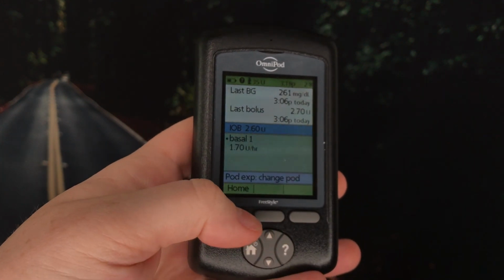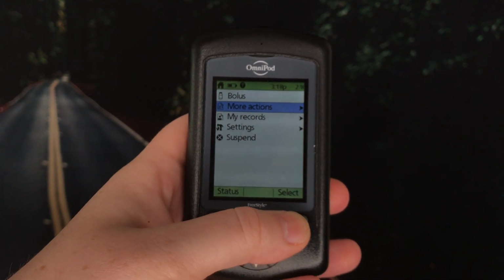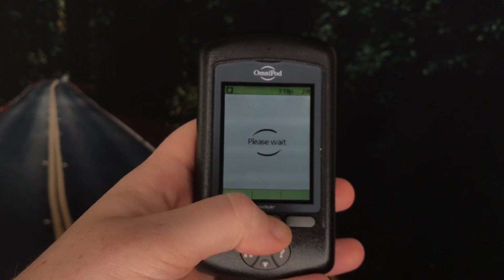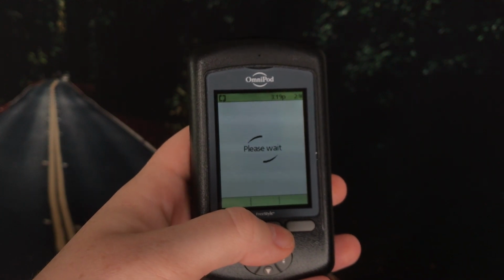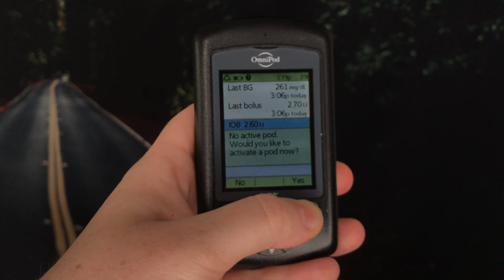After you've turned your PDM on, you're going to scroll down to more actions, and then you're going to press change pod. Once you get there, you're going to confirm, so that way your pod that you're currently wearing deactivates. So with the old pod deactivated, we can actually peel it off now and move on to the next steps, which include the new pod.